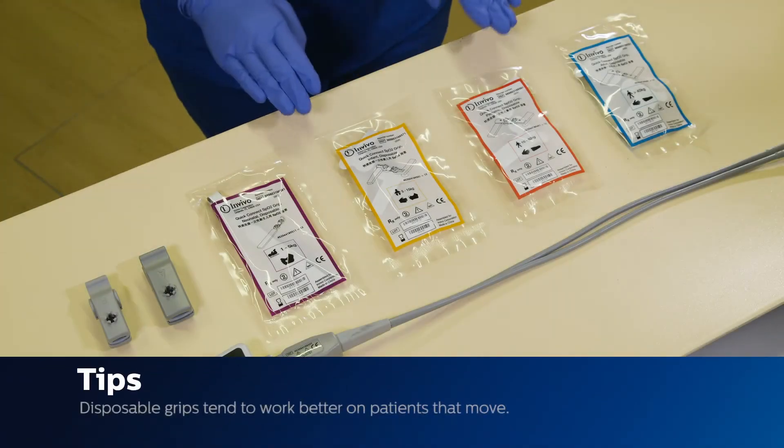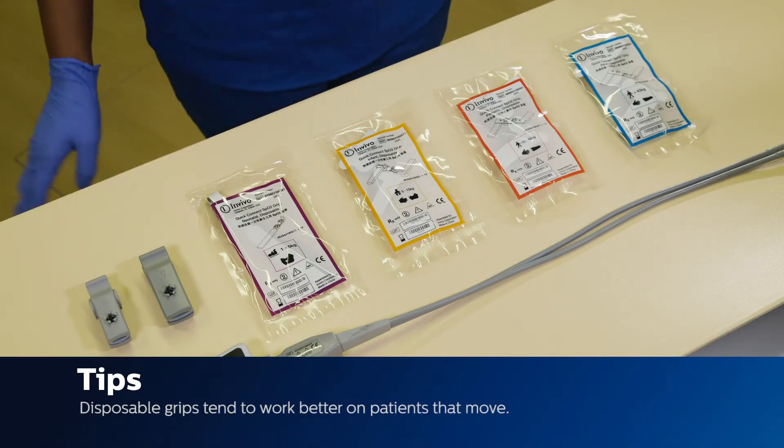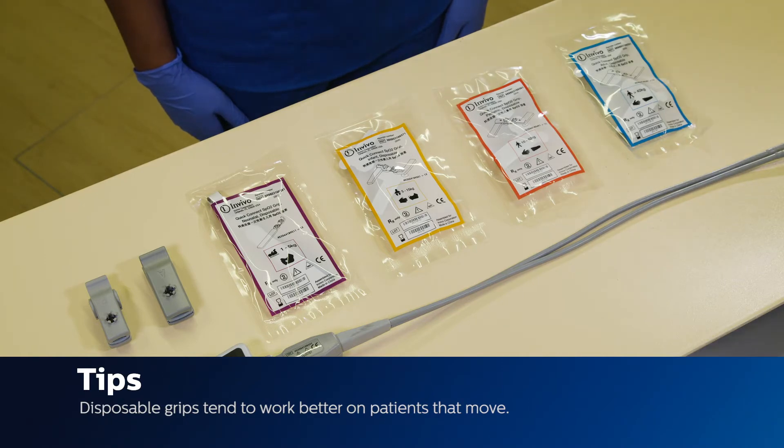Tip: Disposable grips tend to work better on patients that tend to move. It is very secure.